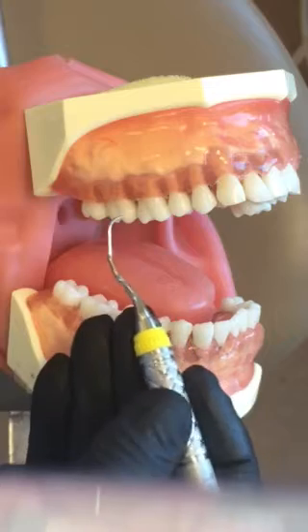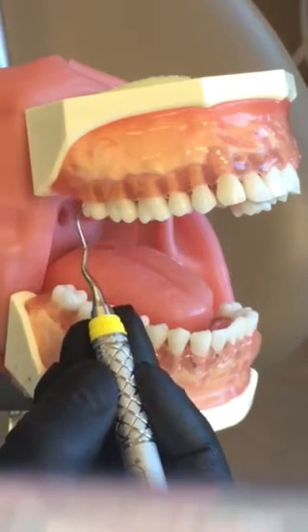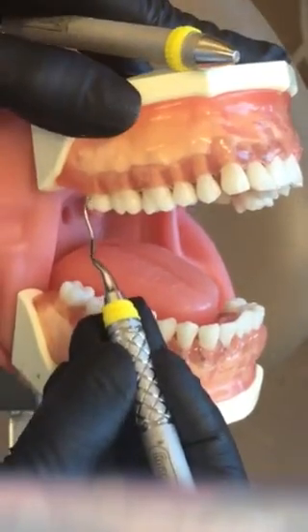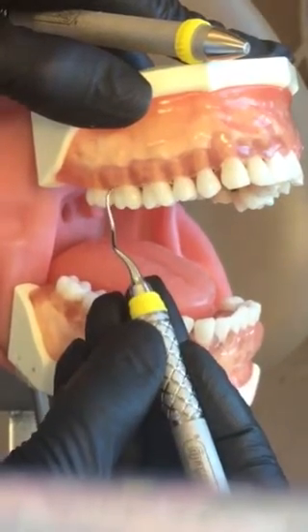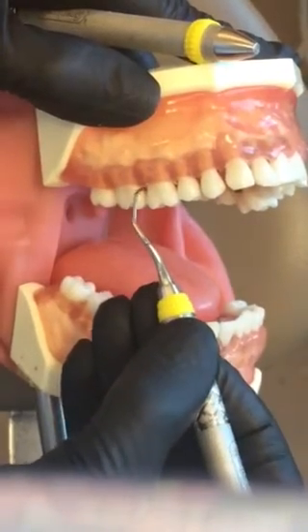This is the correct working end. I'm going to start at the distal line angle, leading with my toe, going across the buccal and around to the mesial. Starting at the distal line angle — across the buccal — and to the mesial.